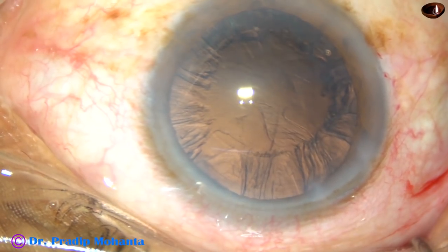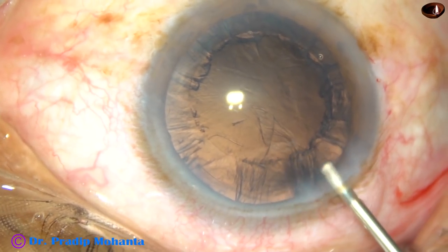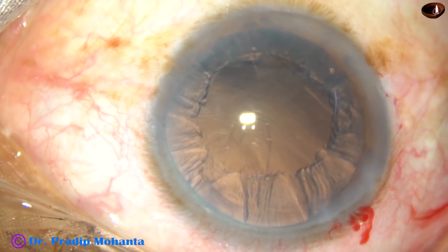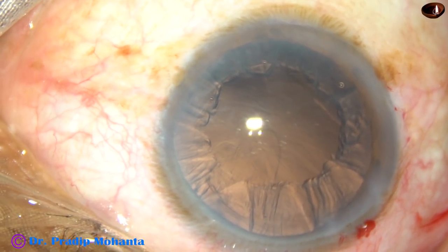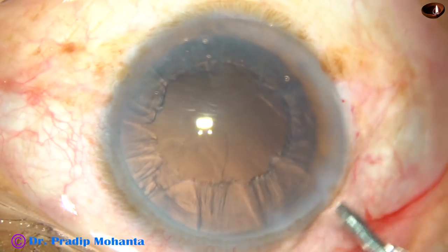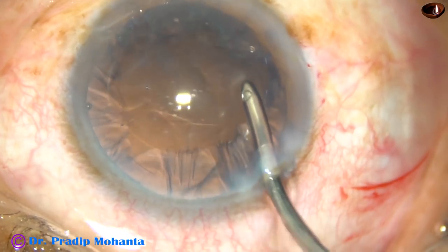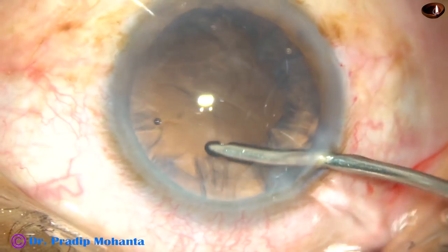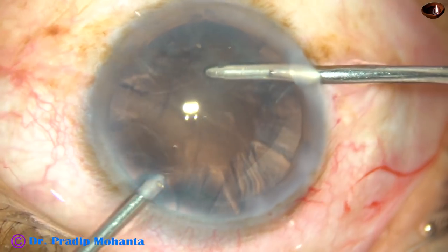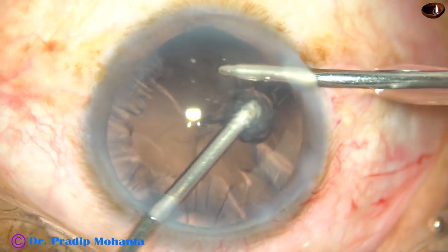The epinucleus has been removed. And now the cortical matter has to be removed. Viscoelastic substance is injected. If you are using bimanual irrigation-aspiration, use the irrigating probe to hydrate the cortex before using irrigation-aspiration together. Go into the bag behind the anterior capsular rim and hydrate all the cortical matter. And now if you use irrigation and aspiration together, see how quickly you can remove it.